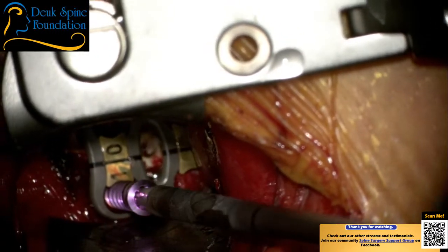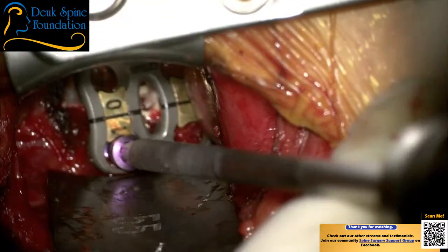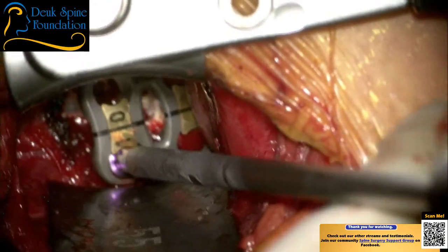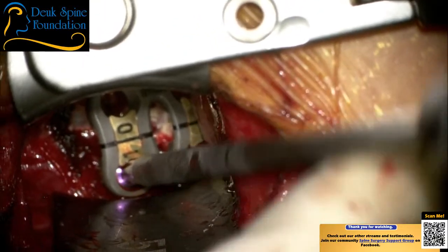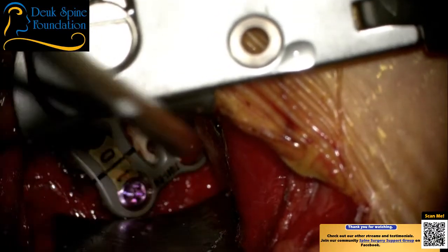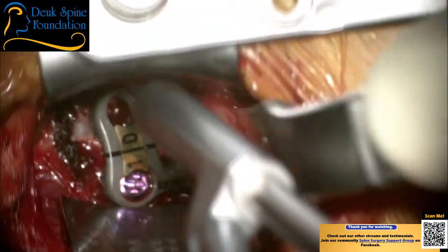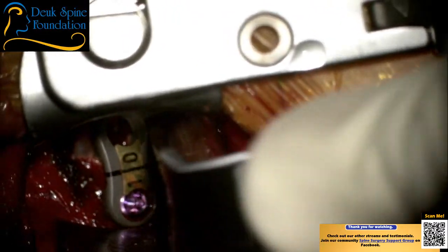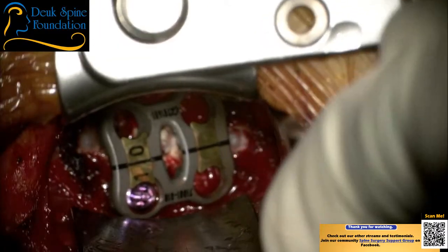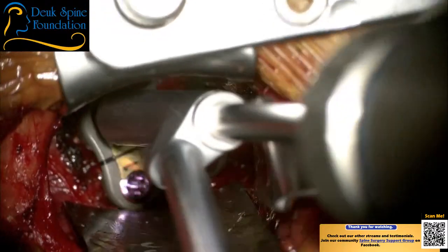So, let's see, I'm drilling up into the bone, and I'm screwing up into the bone. Now, I like to leave this one not too tight. You want to make sure there's no soft tissue. Oh, great. You want to suck, please, and I need you with a retractor, Dr. Patel, helping me. Okay, you should be retracting this soft tissue down here so it doesn't get in my way. I wouldn't leave that exposed, like that's the esophagus. Make sure you're below the esophagus, touching the bone with the tip. I don't want it to pop out suddenly, and you've got to get your hand out of the way. I can't get this down, okay?